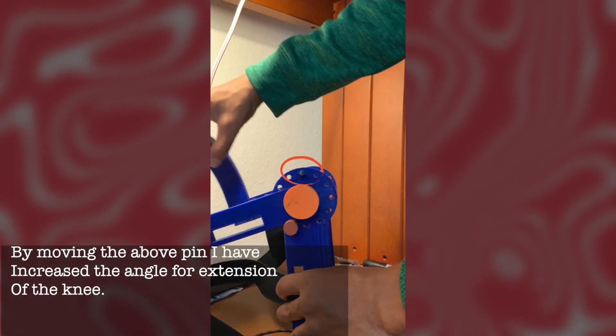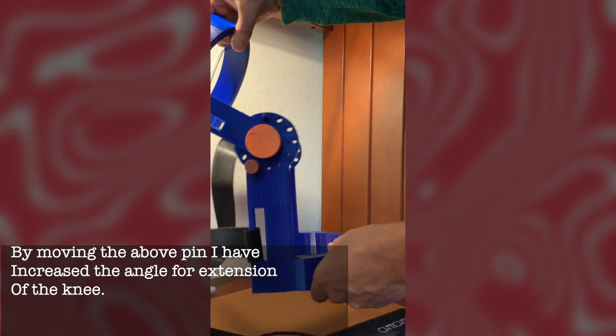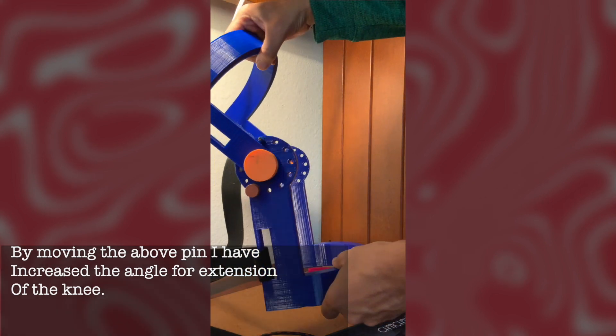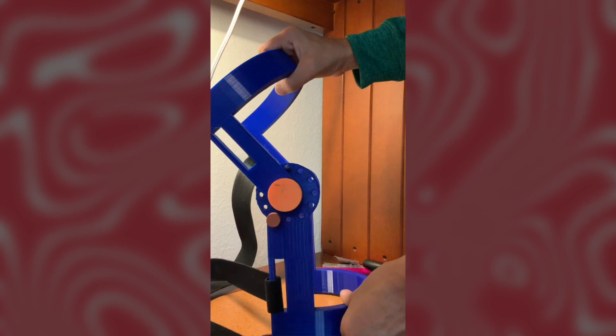Here I've moved the upper pin so that the angle of extension is increased. If the patient's phase of recovery is in an advanced stage, then they can move the pin accordingly so that they can recover faster.